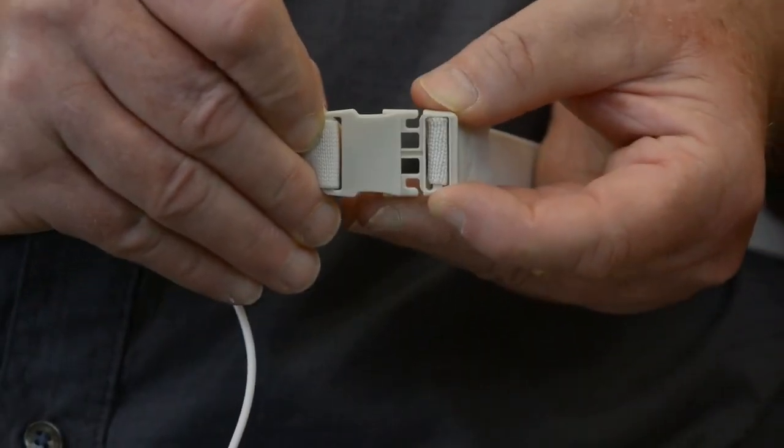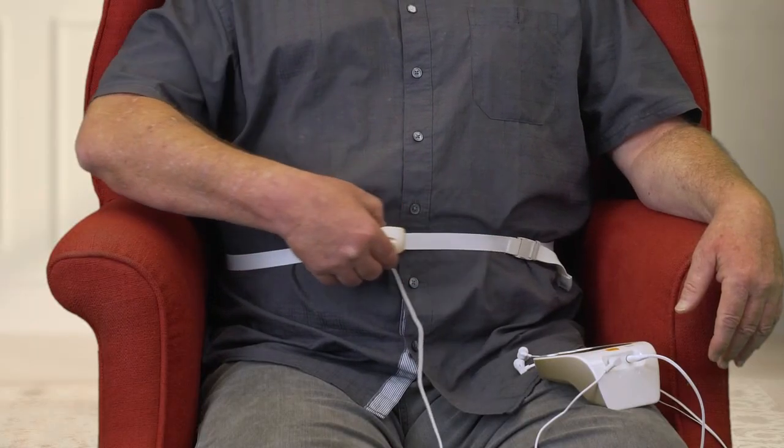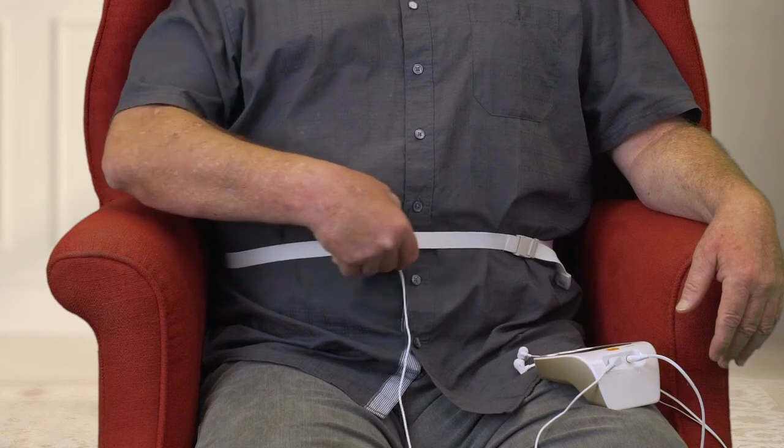Two things you want to remember. First, make sure that the wiring is going down. Second, make sure that the flat side of the sensor that has the numbers on the back goes up against the body. Now bring the belt around your waist with the sensor unit and buckle up front to make it easier to adjust. Make sure you take the male part into the female part and push until it snaps. Then you gently pull and tighten so it fits snug, not too tight, not too loose. You should be able to slide a finger underneath comfortably. Now slide the sensor unit right and left to ensure it moves freely and bring it into place.